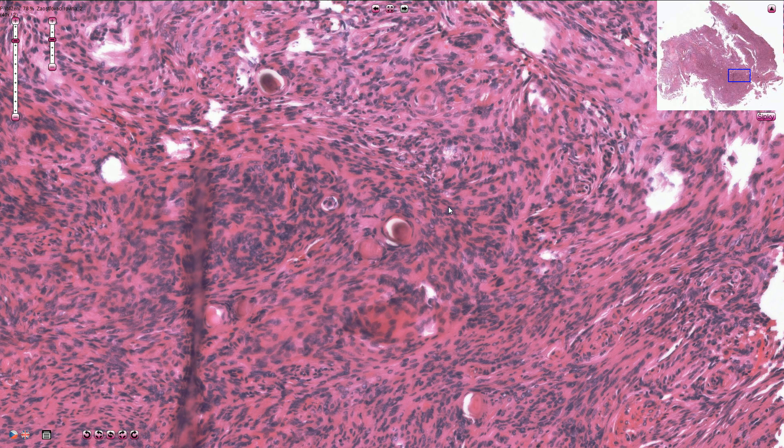Grade 1 meningiomas are typically well-circumscribed tumors with a pushing margin; however, they can sometimes infiltrate the bone tissue.